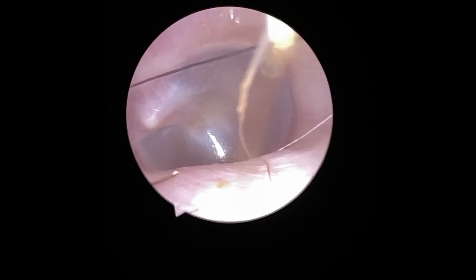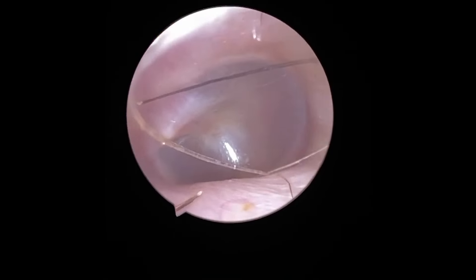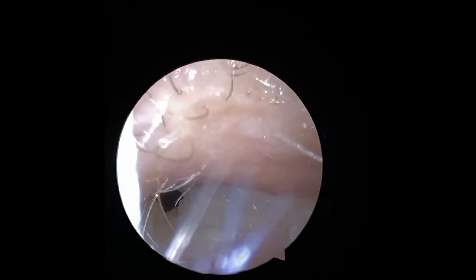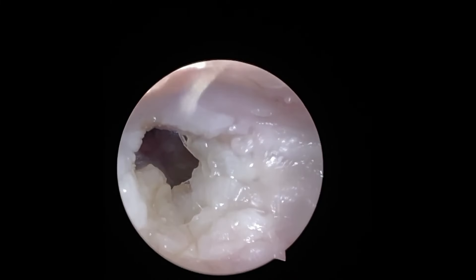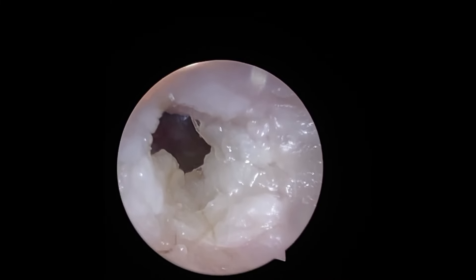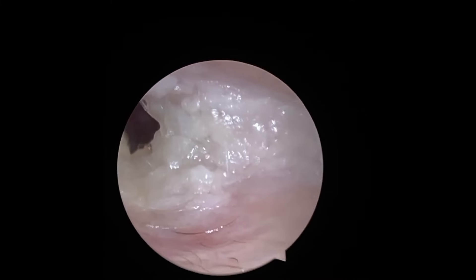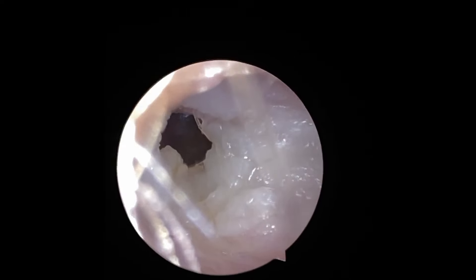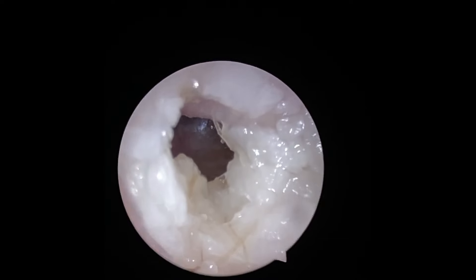Not much else to say about this one, so I am now moving over to the right side. On this right side, immediately you can tell there is something completely different looking about the blockage. The reason for this is that the patient overused a 3% hydrogen peroxide in this ear, which caused all of the bits of keratin in his ear to gather in one place and create this whitish looking blockage.